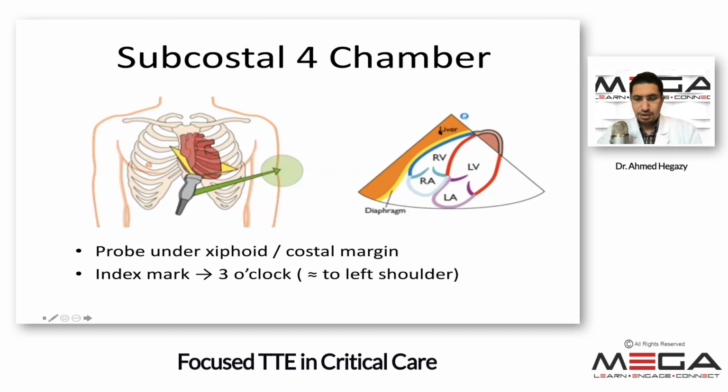And the unique aspect of this view is that you're actually looking through the liver. You're not looking through lungs. You're not negotiating the lungs, essentially. You're actually looking through the liver. The liver here is your acoustic window. And this can be an advantage.